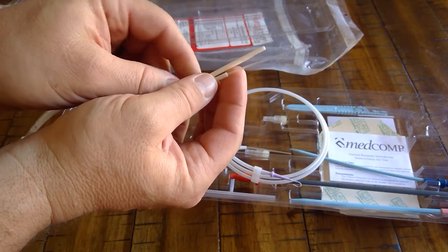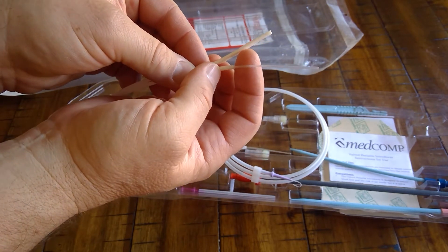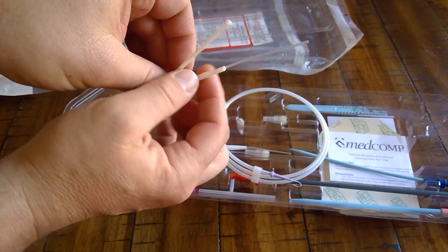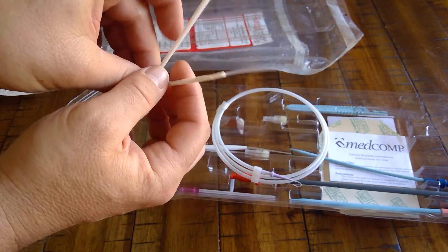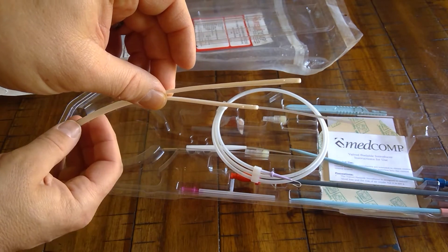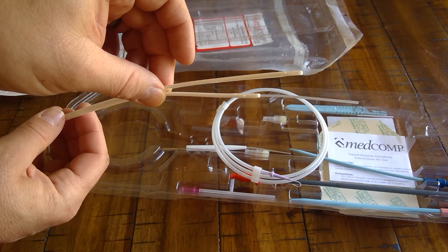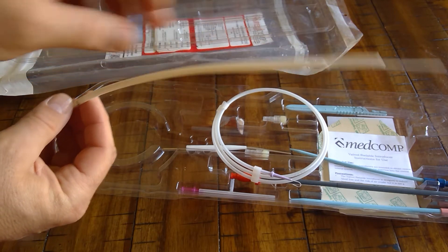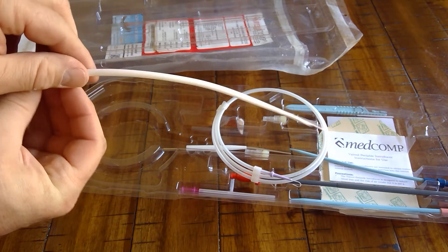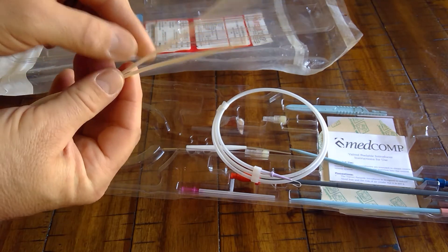At the distal end you'll notice it's slightly split when it comes out of the package. The physician is going to further split it like a banana peel. Pull it apart — you can't break it; it's tough polyurethane that softens when in the body, but you can split it. Usually halfway is the most common amount of splitting, halfway to the mark that says 'do not split past this point.'